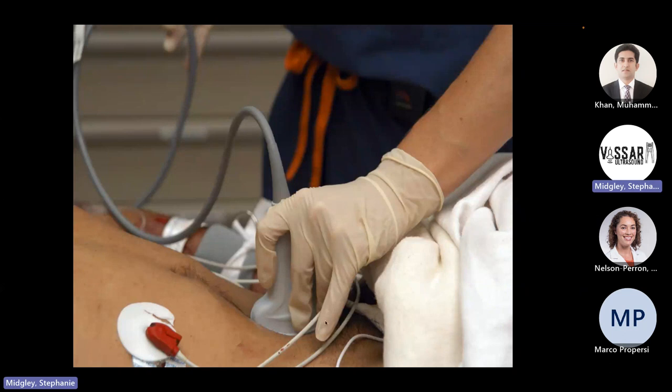So once you find your bladder, then you're going to rotate your probe marker so it goes up towards the head. Try to keep that bladder in your view. And the important thing is you have to adjust your rock so that your beam is still aimed down into the pelvis. Because if you're looking up towards the head, you're going to miss the bladder because the bladder is living down here.